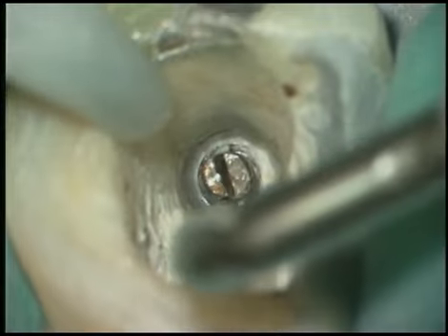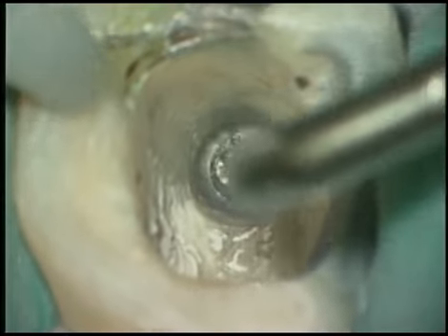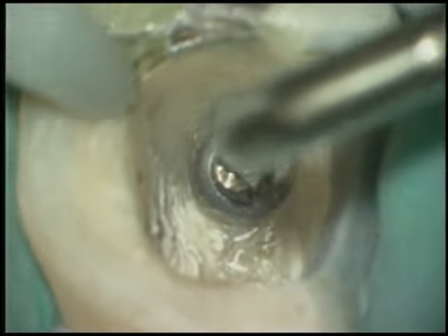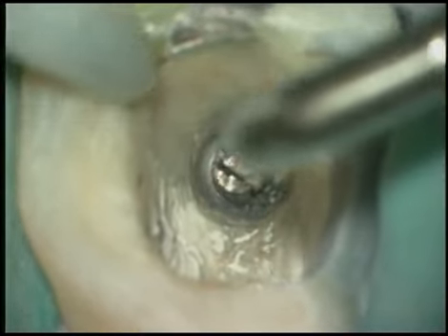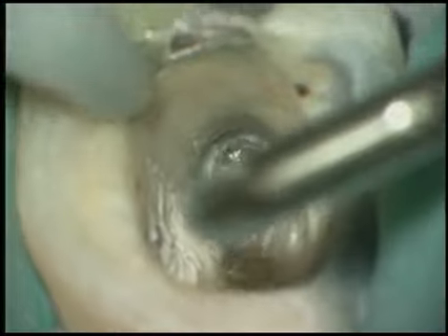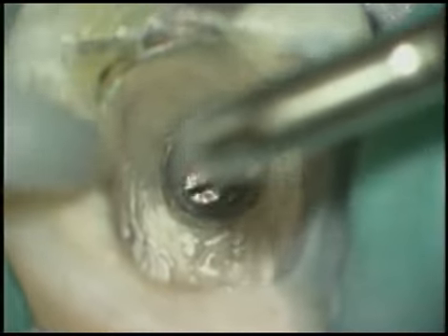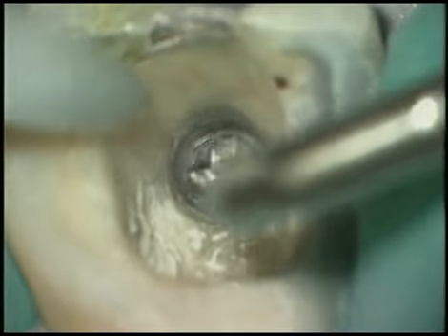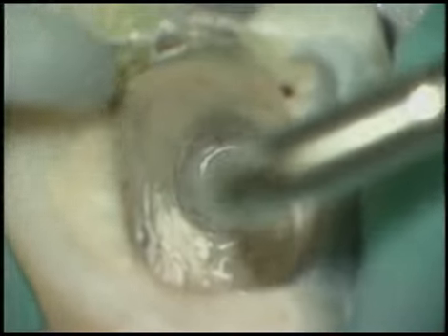There's a little movement. It's quite encouraging after a few setbacks to see that with a little bit of patience and determination, usually we can be successful. When the post begins to move like this and vibrate, we know it's just a matter of moments before it'll be liberated from the root canal system. Progressively move around the post in a counterclockwise motion, and that will generate the energy necessary to move those flexi post halves and blow them out.